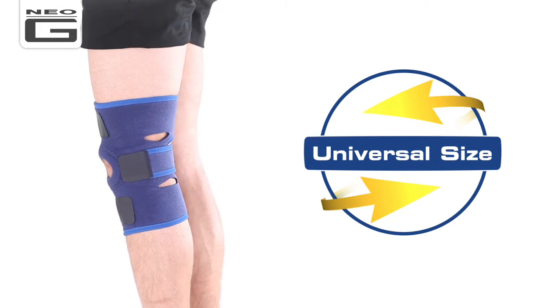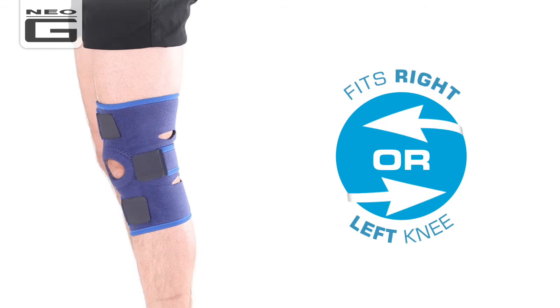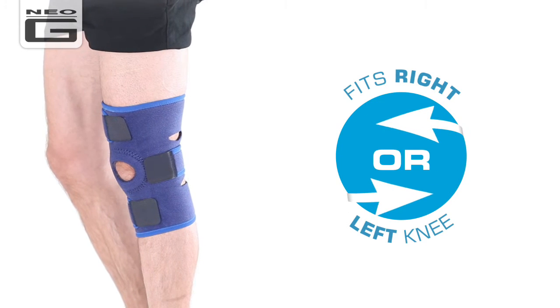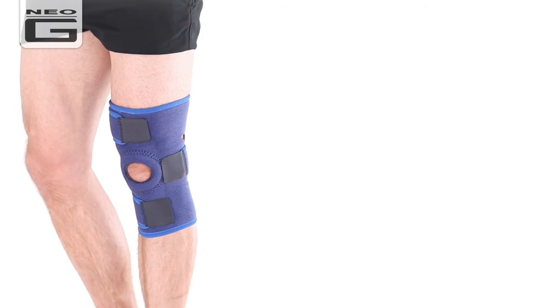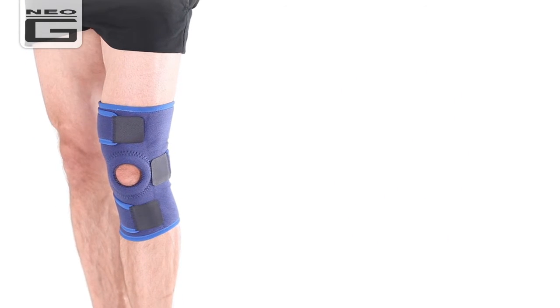Universal in size and adjustable for best fit, this support fits both left and right knees. It offers dynamic support and adjustable compression to the knee complex without restricting movement.